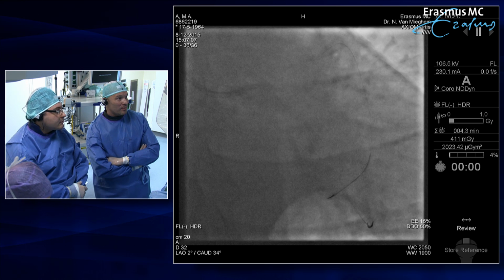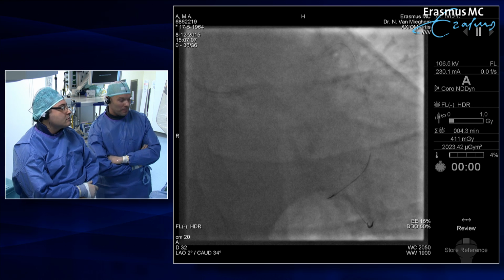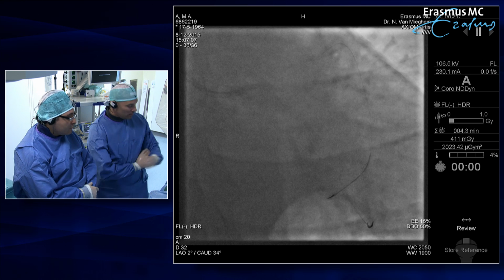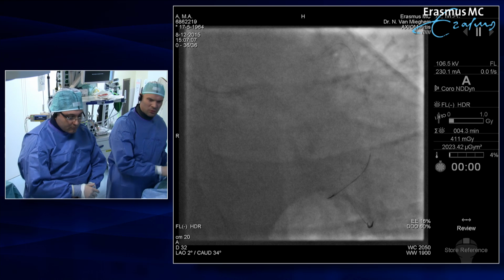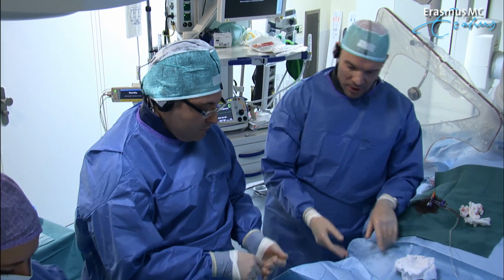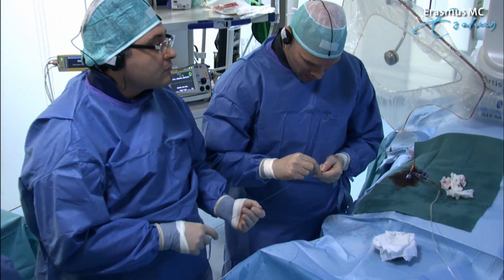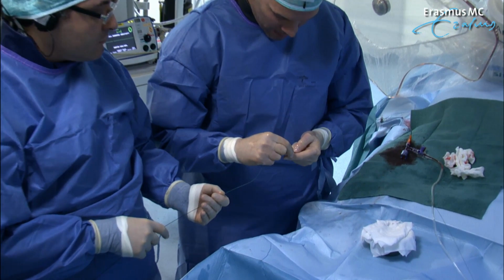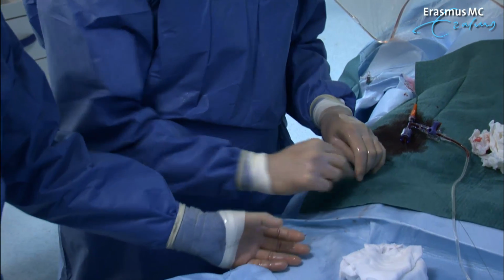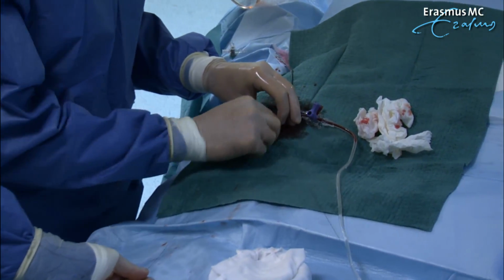Sure. That being said, I'm not sure if a stent will cross that distal carina. So first of all, I would prefer ballooning the ostium of the circumflex. So let's do that with a 2.0 by 10 Pantera balloon. This is a semi-compliant balloon, one of our workhorse balloons in the cath lab today. And let's try and prepare this bifurcation.